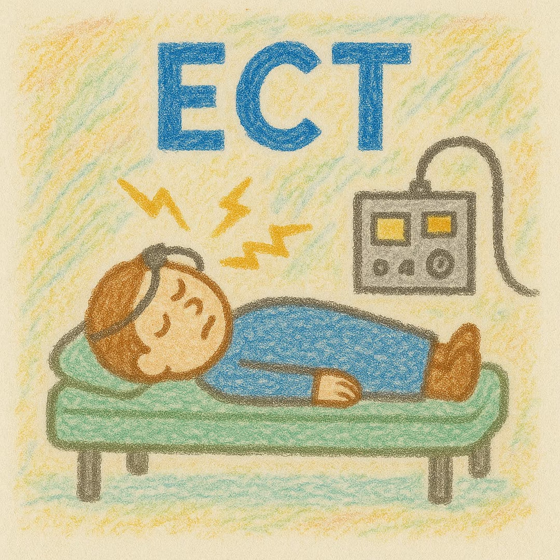And then you, as the ECT practitioner, would go see them and do a brief assessment. Just basically a psych review of systems, make sure that they're feeling physically well for the procedure, they don't have any new questions beforehand, etc. And then they get wheeled over to the actual ECT suite. Before the anesthesia, you would hook them up to the EEG recording leads. For ECT, we usually have a 2-channel EEG, basically one channel recording the overall brain activity of each hemisphere of the brain.